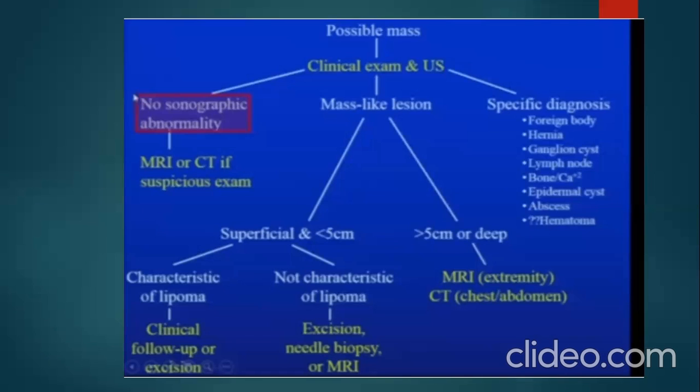But if they are characteristic of a lipoma, you might just need to follow it up clinically or even with ultrasound. Or you might recommend excision, because some of these patients are not comfortable staying with these lumps and bumps, so they might just need them to be removed. And if you get no ultrasound abnormality, but your exam is suspicious, you need to recommend further evaluation with other imaging modalities.